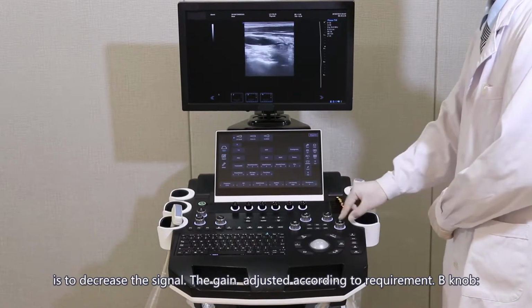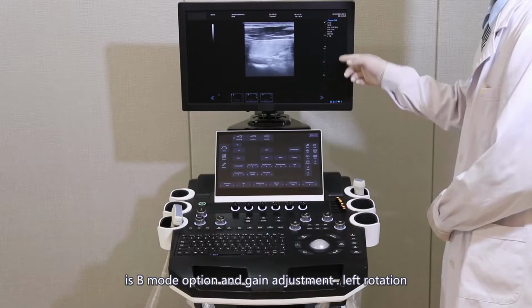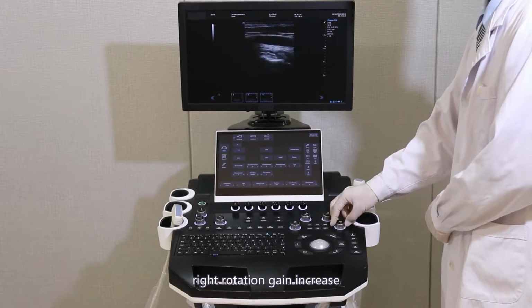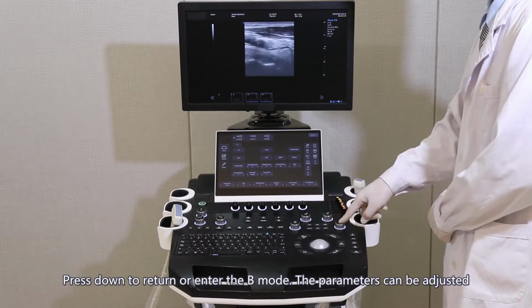B knob. It's the B mode option and gain adjustment. Left rotation, gain decrease. Right rotation, gain increase. Press down to return to or enter the B mode.